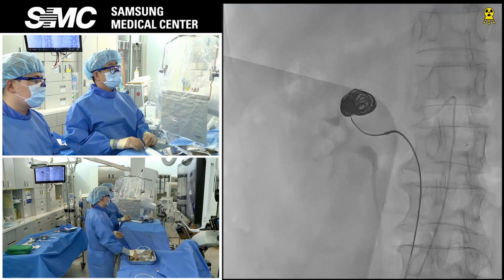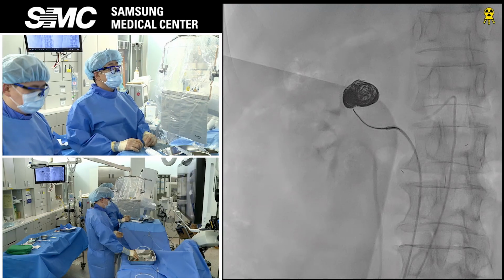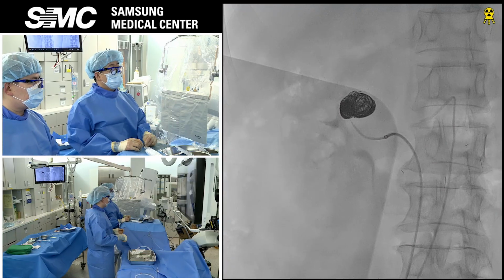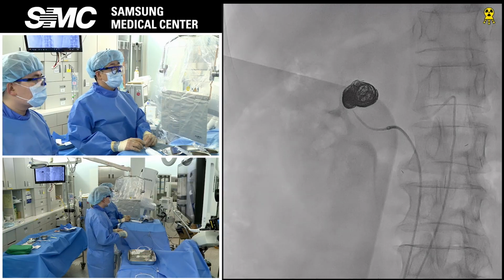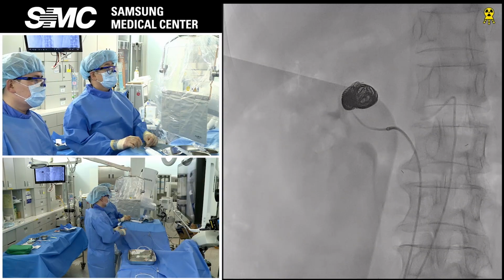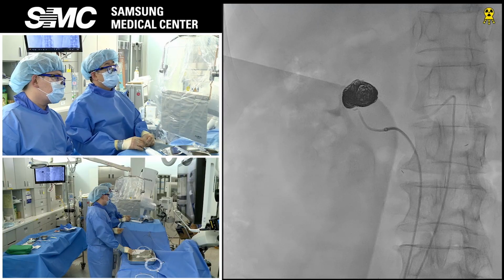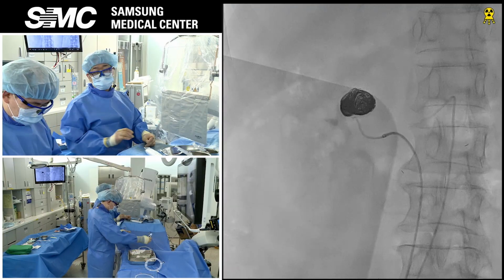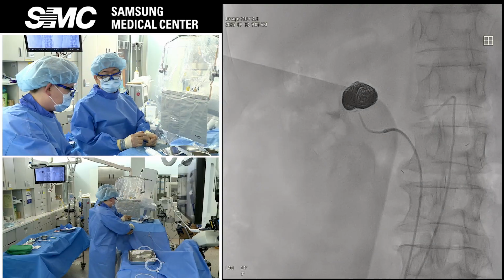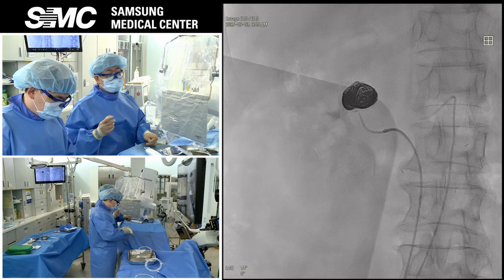We do transvenous coil embolization for type 2A AVM, and in that paper, for another type of AVM, we can use a different treatment strategy. I will check the venous catheter angiography to determine the status of the AVM after this coiling.